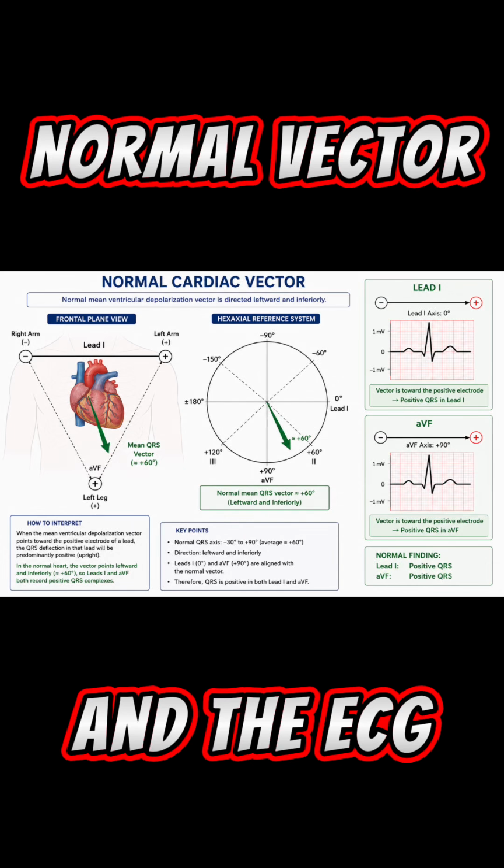If the electrical impulse is traveling away from the positive electrode and towards the negative electrode, this is going to give you a negative QRS complex in that lead. So for example, in lead 1, if the impulse is traveling from left to right, away from the positive electrode, you will see a negatively deflected QRS complex in lead 1. The same theory can be applied to aVF. So if the impulse is traveling from the left leg up towards the right arm, you will have a negative QRS complex in lead aVF.